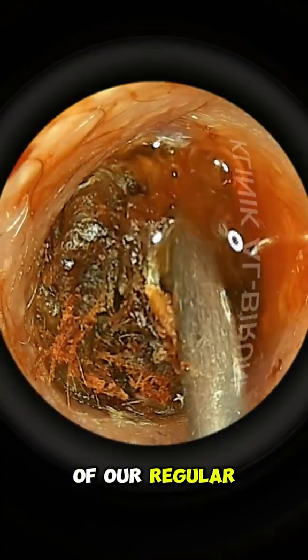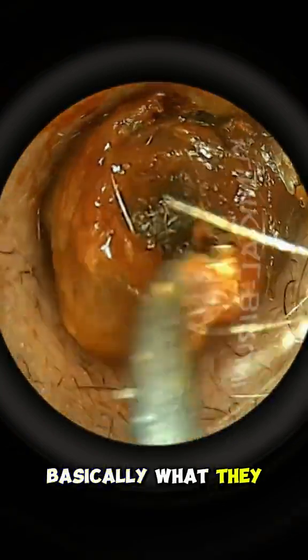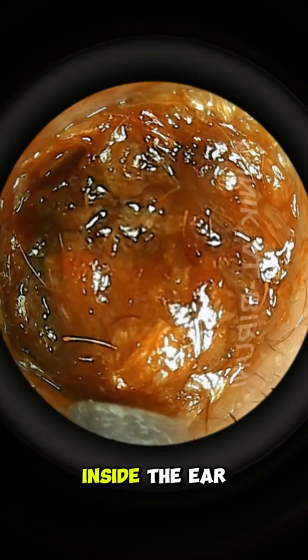Oh, this is one of our regular patients, bless them, and they came in for an emergency appointment. Basically what they'd done, their ear canal was itching, so they used a cotton bud, naughty patients, and what's happened is the end of the cotton bud, the end of the Q-tip has come off inside their ear canal.